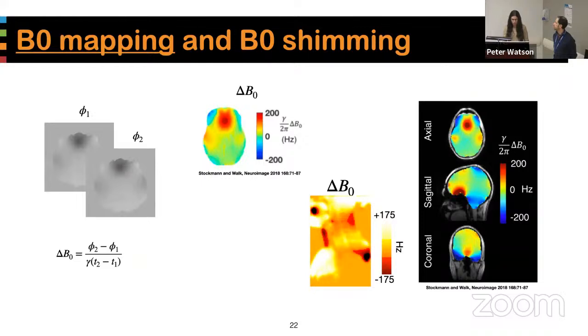Okay, so the scale, we measure it in hertz. Proportional, so it's proportional to the frequency, or it is the frequency. And around the spinal cord, as you approach the lungs, so at the end of the cervical spine, you typically have about 100 hertz positive or negative offset.